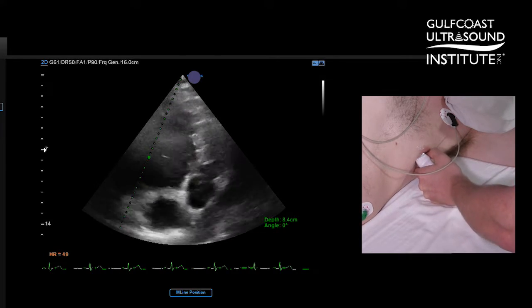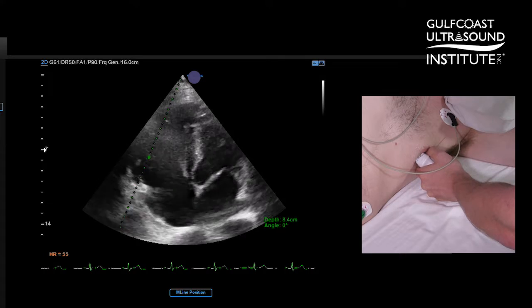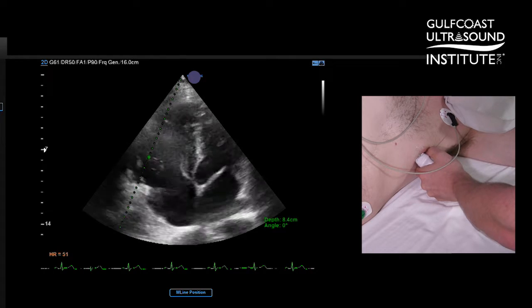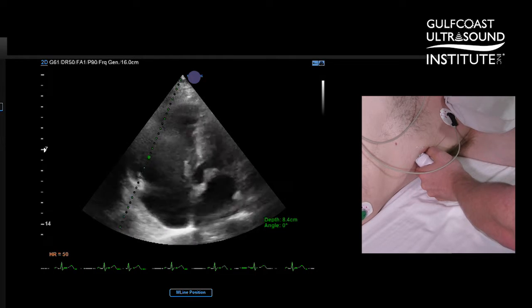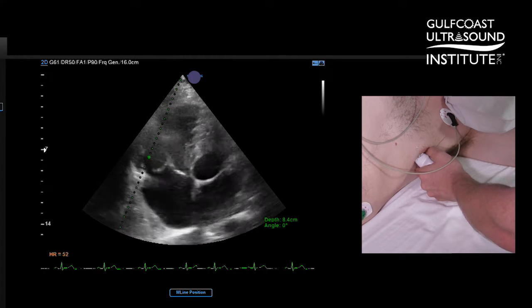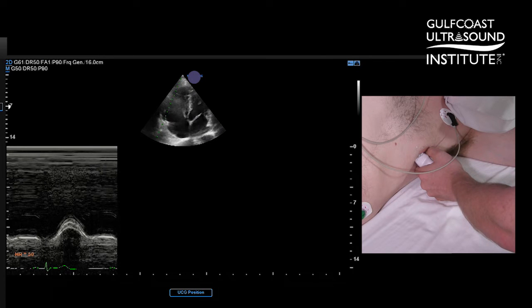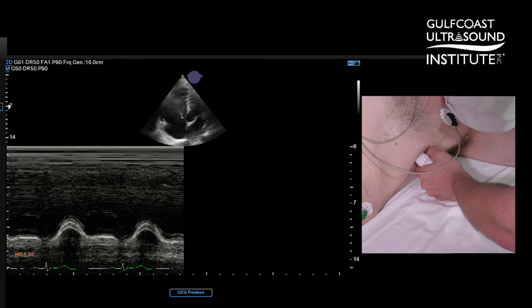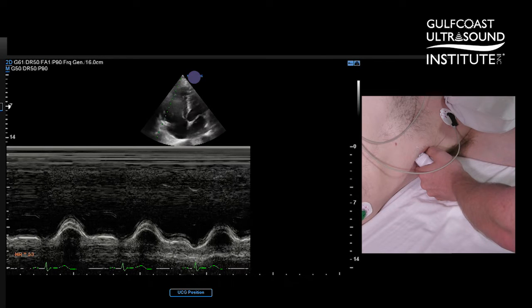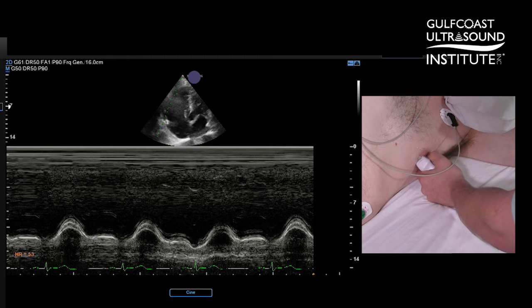When we are in a standard four-chamber view, sometimes what happens is we get the RV free wall in the way. The ASE recommends that we use this more modified apical four-chamber view for our TAPSE — right here we can get a nice crisp measurement.